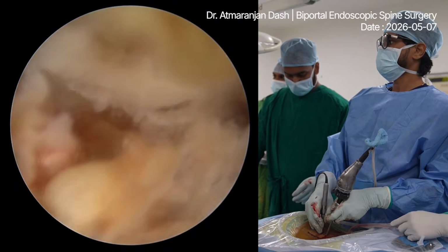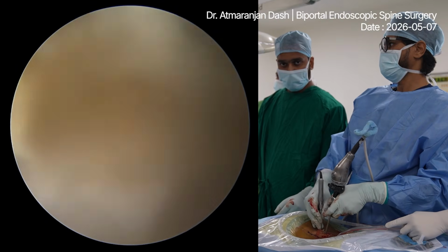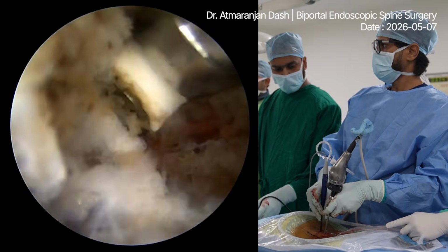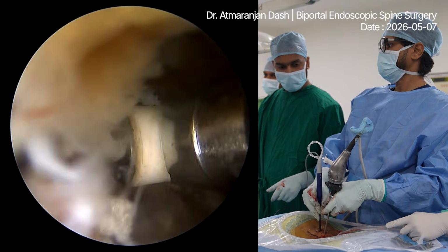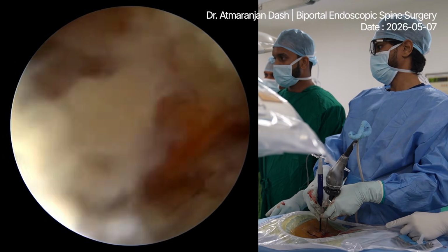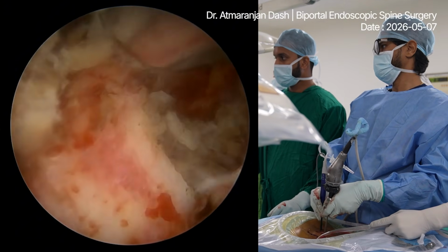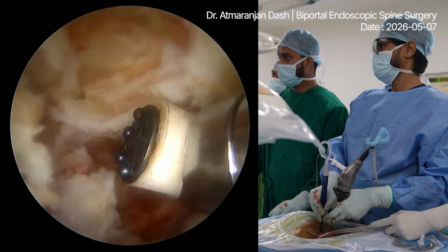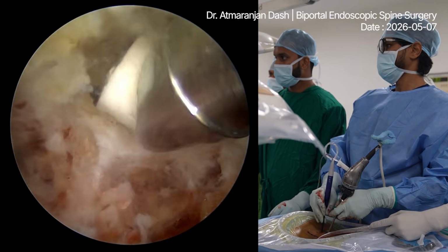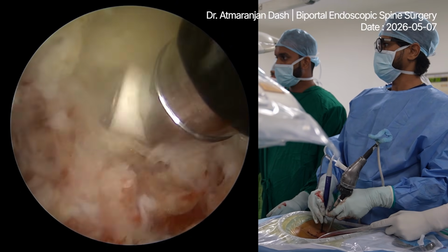Take a shoot. Coagulation, please. So this is the foramen.